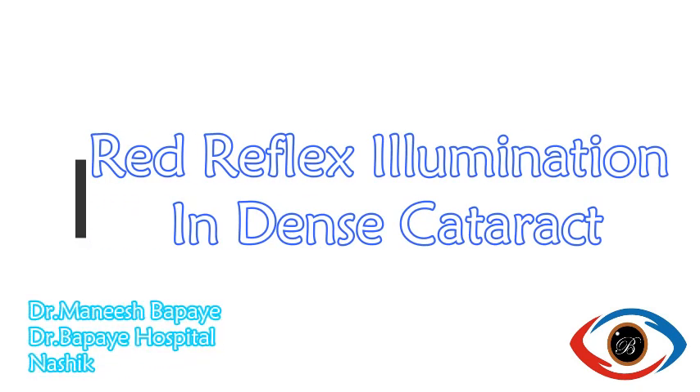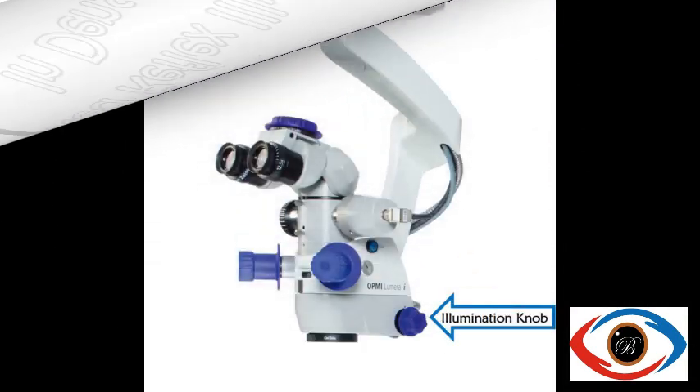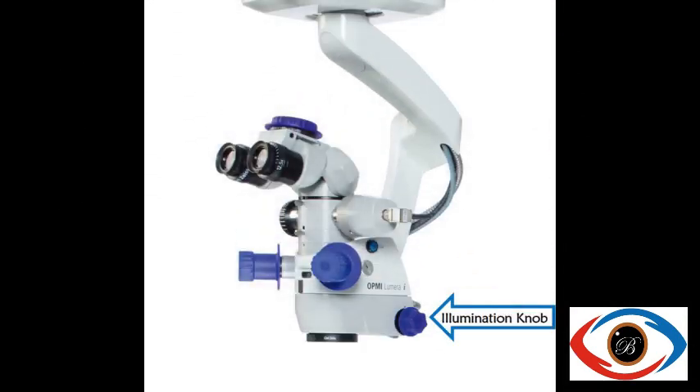Red reflex illumination setting on Zeiss microscopes can be achieved by turning the illumination knob into position 1. This setting provides optimum red reflex by reducing scleral glare and is helpful in dense cataracts.